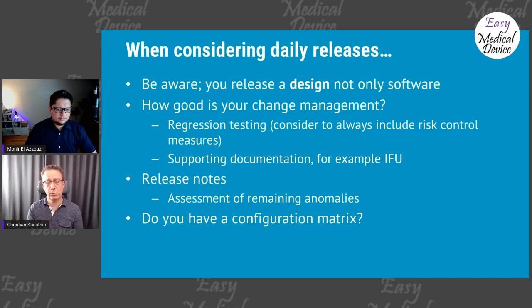What you could try to explore is to use, let's say, major, minor, patch release numbers. If you do patch releases, that's always a green card. You don't need to consider anything else. When you step up one more in the version number, you need to do a little bit more, and when you change the upper number, you need to do everything.